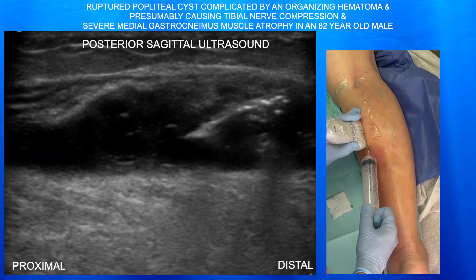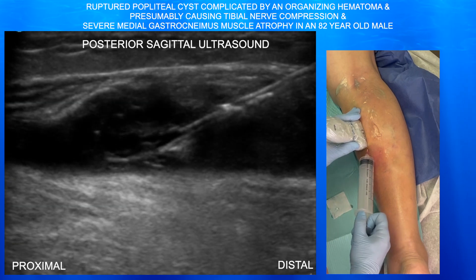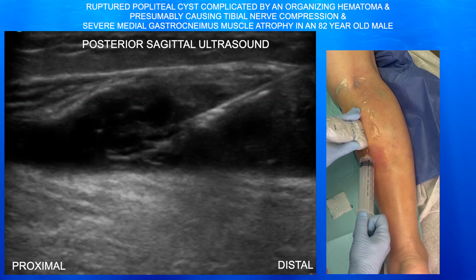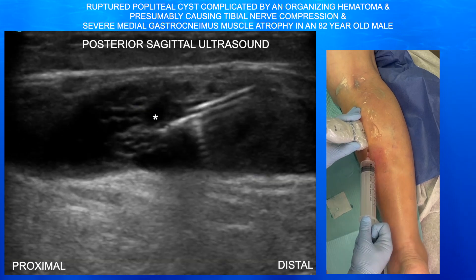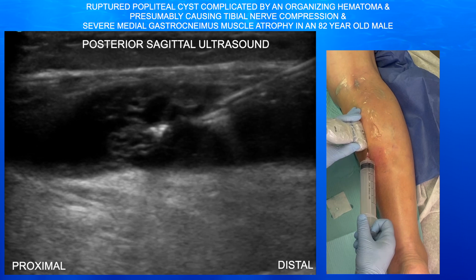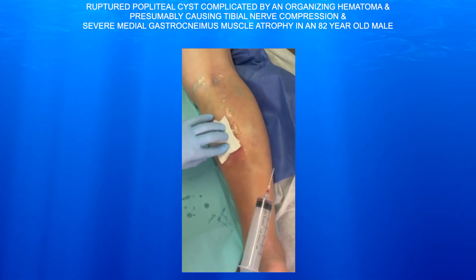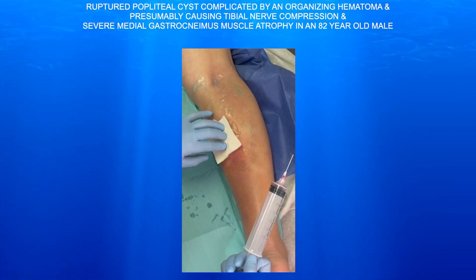Even though I was not very optimistic, here we are going in trying to drain what we could, given the fact that he was having significant symptoms. We were able to get a little bit of fluid out of that dark pocket, but essentially didn't get much at all, as this is essentially an organizing hematoma. So we recommended that he see a surgeon for surgical evacuation of this organizing hematoma mixed in with this ruptured popliteal cyst.